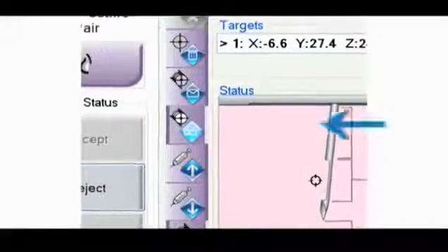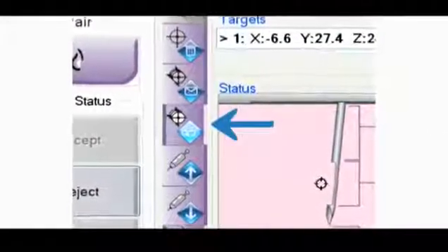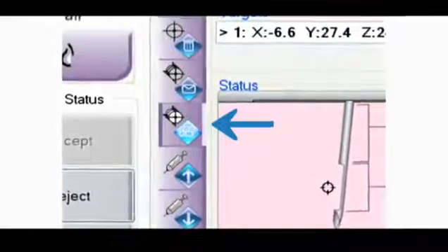Depending on your facility protocol, take a pair of pre-fire stereo images to determine that the area of interest is correctly targeted. Activate the project target button to ensure that the injection of anesthetic has not caused any lesion movement. Next, fire the Aviva biopsy device by fully depressing the green button on the remote firing mechanism, advancing the needle to the target.